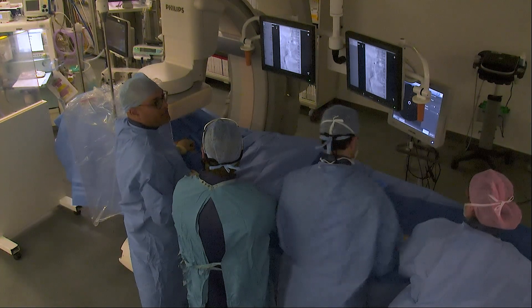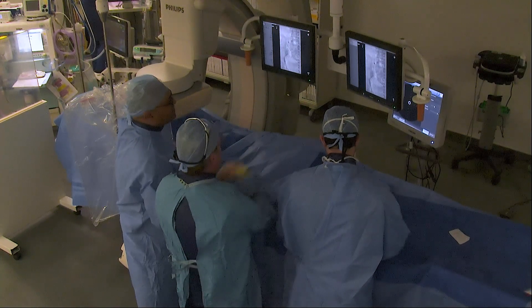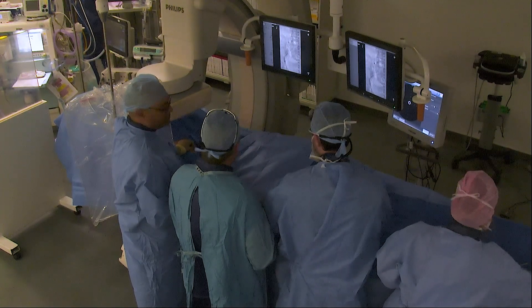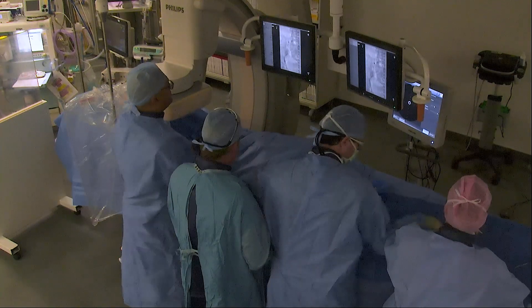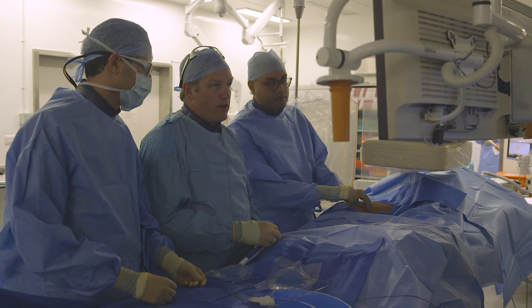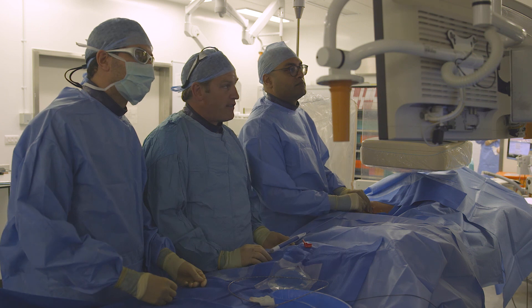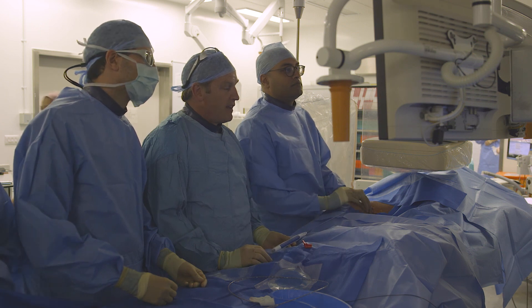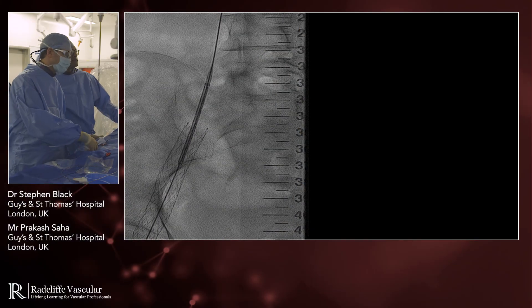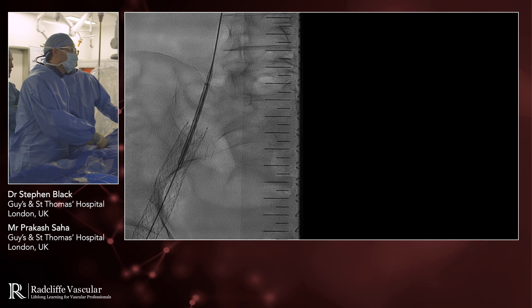We're going to do a 120 and then a 120, and that would be a full stent. This is less important than overlapping under the ligament — we haven't really seen problems there, but you can get a little bit of tenting and straightening. The principle is we probably could have used a slightly shorter first stent to keep the overlap a little bit further down in the external iliac vein, which is a much more stable place to overlap stents.